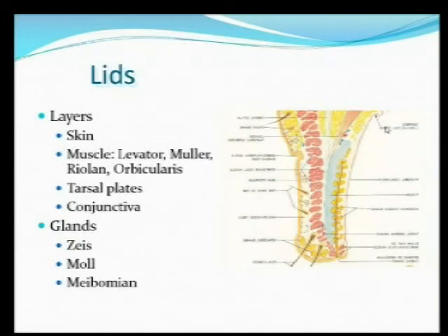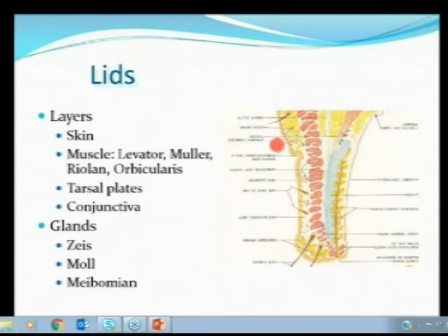So if we're going to bend the lid, we're going to wind up having to put a Q-tip right about here, and then grab the lashes, pull out a little bit and up, and that lid will flip, exposing that inside lining of the lid, the conjunctiva, so we can see if it's being changed at all through contact lens wear. And then again, finally, on the inside, we have the conjunctiva.